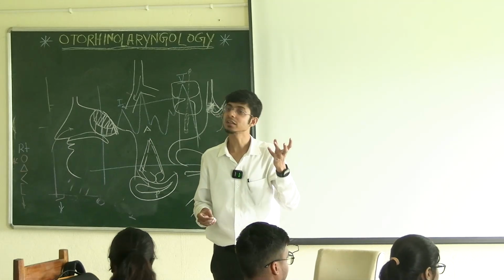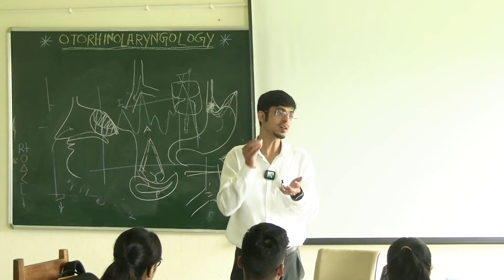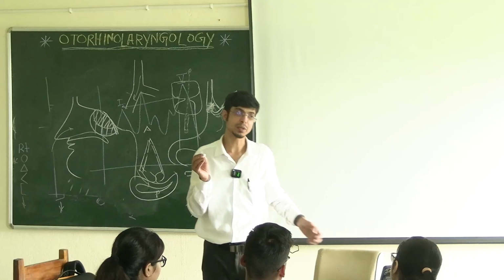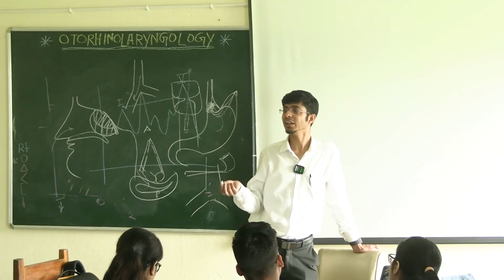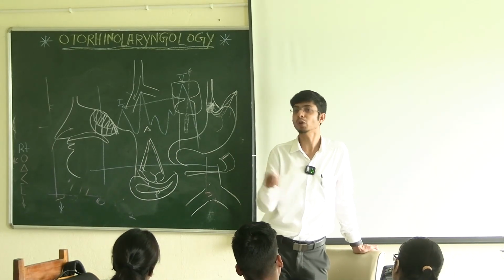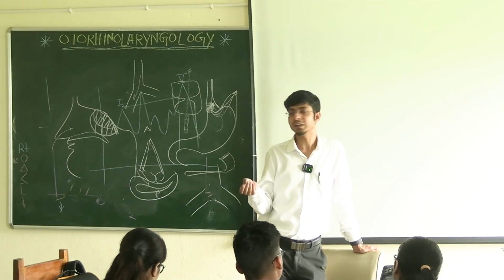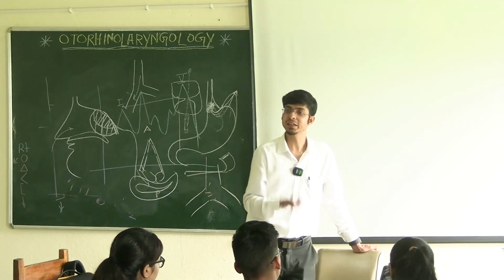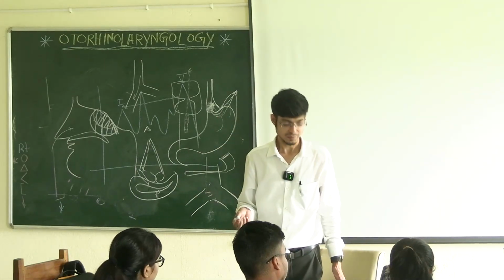So these are mostly acrylic, so you won't see them on X-ray. But sometimes the denture is attached with a wire, so the wire usually comes up on X-ray. But if we absolutely cannot see it and the patient is saying that I have surely swallowed it, either you go for a CT scan or something. A CT scan will also not pick up properly, because CT scan is just a modified X-ray, nothing else. But it gives a better visualization of the soft tissue. So it might pick up, otherwise you directly go for an esophagoscopy and find out. You may do a flexible one first to see whether it is there or not, and then do a proper rigid one to take it out. Okay?